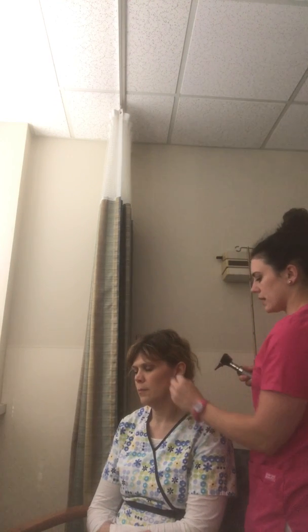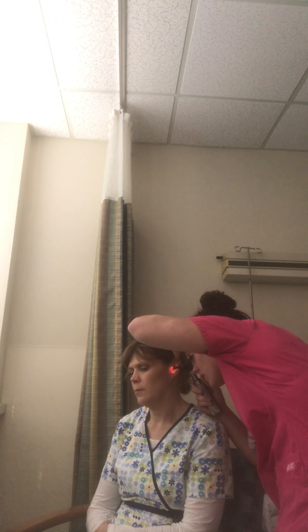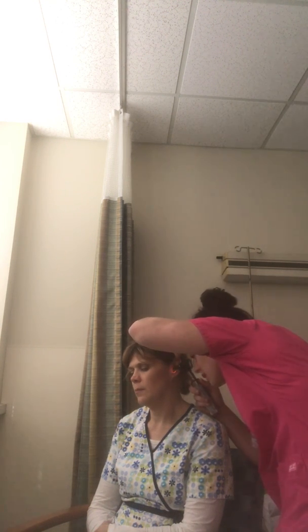You can see that her tragus is soft and movable. Her pinna is soft and movable. There's no drainage. Now we're going to go into the ear. Auditory canal is pink and intact. Her tympanic membrane is pearly gray. It's not bulging, it's neutral. The cone of light can be seen at 7 o'clock. So that is all completely normal.